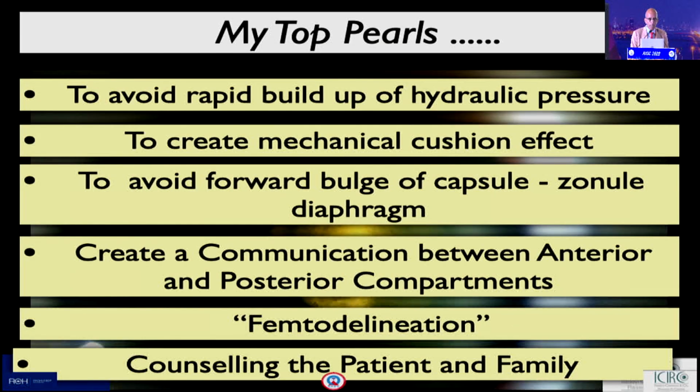So to sum up, these are the pearls I learned from the stalwarts sitting on the dais, Dr. Osher and many others. So keep them in mind, and good luck when you have this kind of case next time.